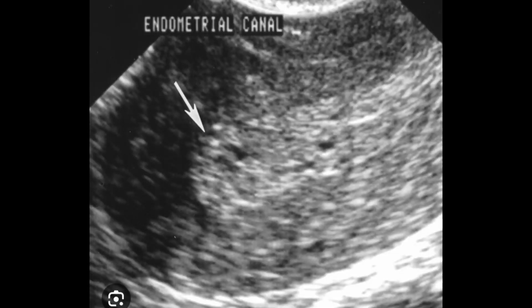This is another transvaginal scan, and in that case I would myself suggest this type of endometrium with hyperplastic changes. Whenever there is hyperplasia of the endometrium, a focal part will show cystic degenerative changes, or maybe cystic changes because of glandular activity.